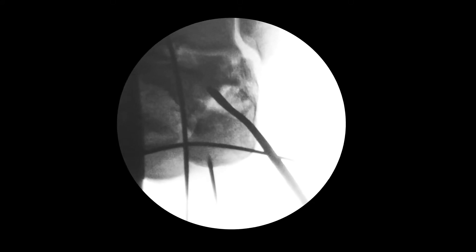Here I must pay tribute to some luck, because the massive middle fragment was followed by the lateral one and it had stood in the correct position.